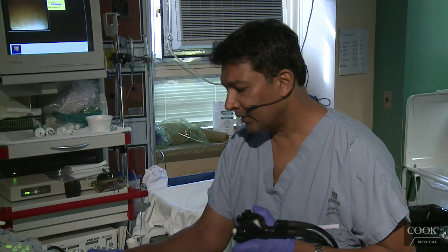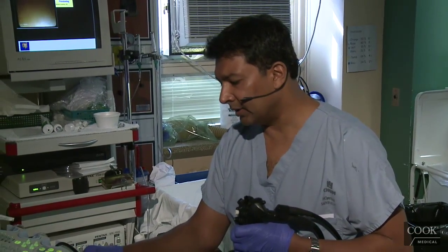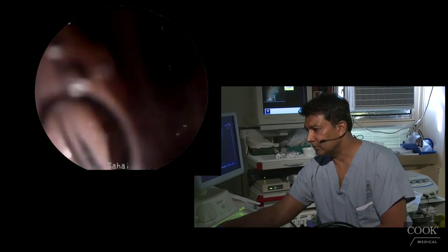So again, keep the balloon up a little bit. I think it's safer. Put the scope in the mouth. Just let him get used to it. Then tip down. Pull it into the back of the mouth. Put the head forward.